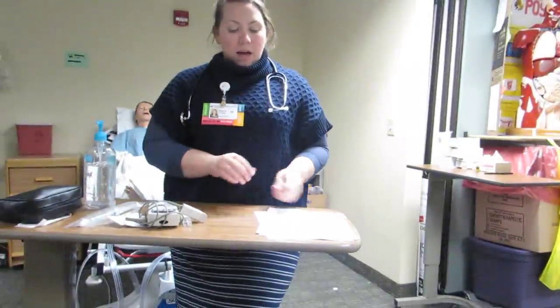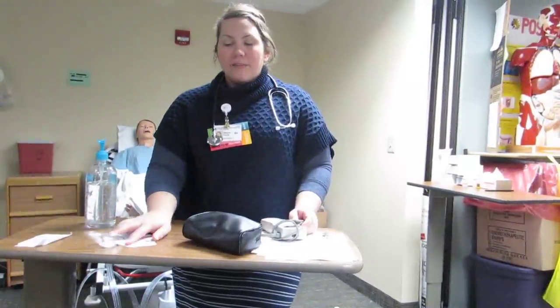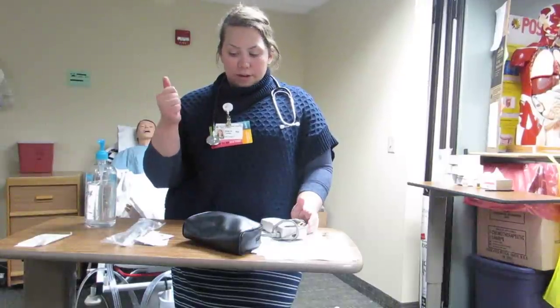Okay, so supplies you're going to need to do your head to toe assessment are a pulse oximeter, a stethoscope, a thermometer, and a blood pressure cuff so you can do a set of vitals. You're also going to need an IV flush because you're going to be assessing an IV. Then at the end of what I'm going to show you, I'm going to talk about some of the other skills that you might need to demonstrate during this. But for a minimum, everyone's going to need enough supplies to do vitals and to do an IV flush.